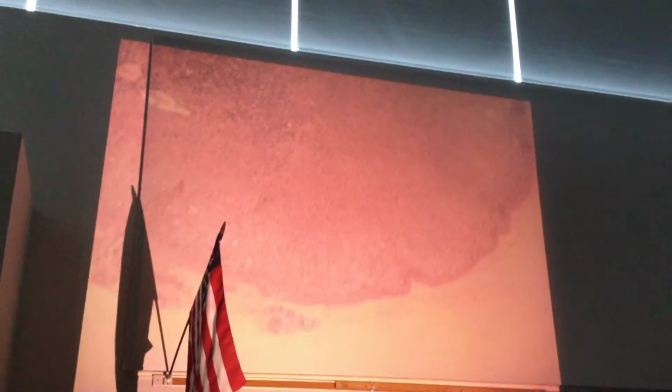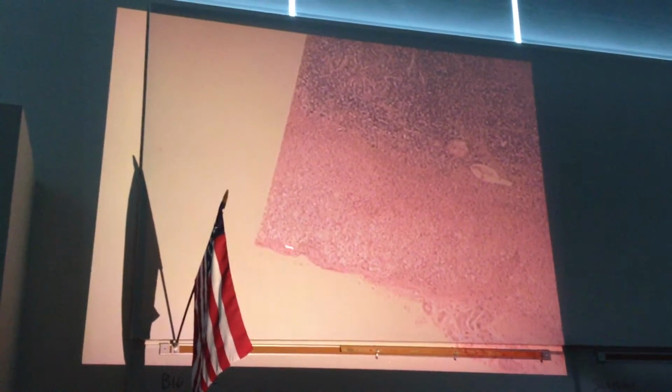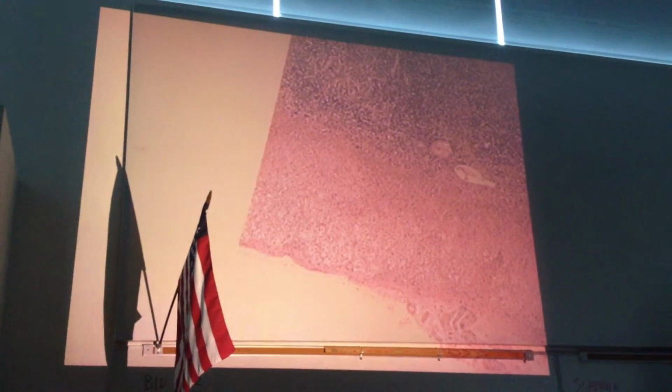Next one is the adrenal gland. That's that pyramid-shaped gland that sits on the superior surface of your kidneys. And we come over here, we're going to look at 3 parts to it. I'll show you at low magnification and we'll go to higher. The connective tissue covering on the outside, that's right here, is the capsule of the adrenal gland. And immediately inside, in the relatively light area, that's called the adrenal cortex.